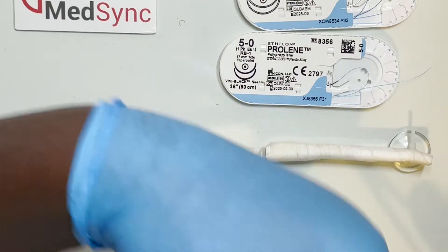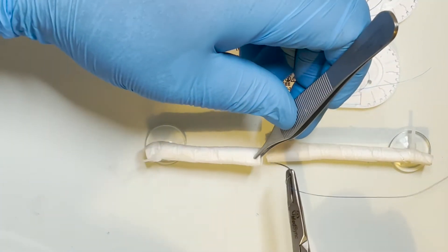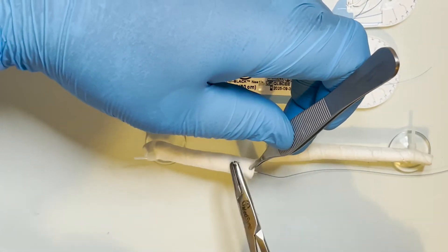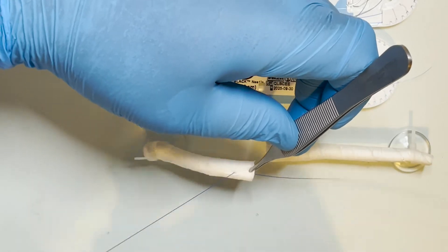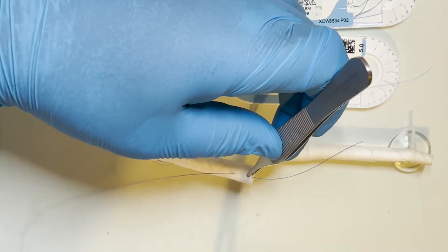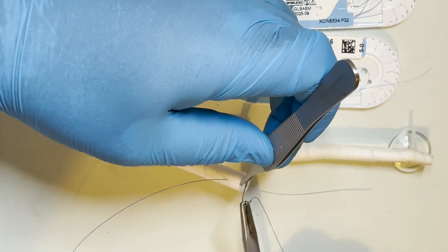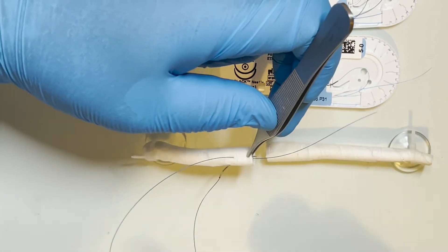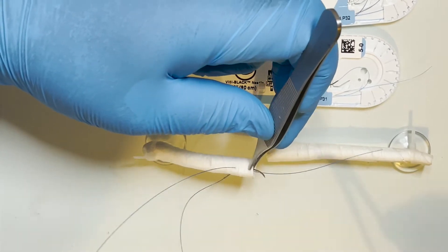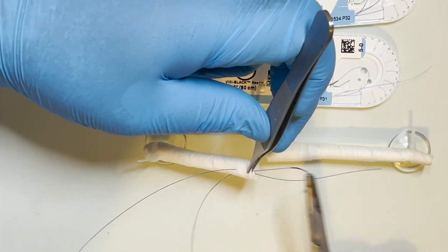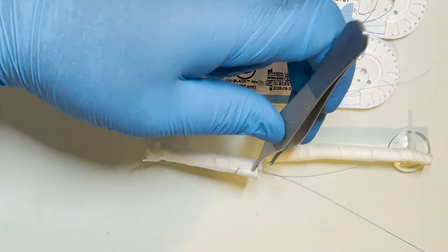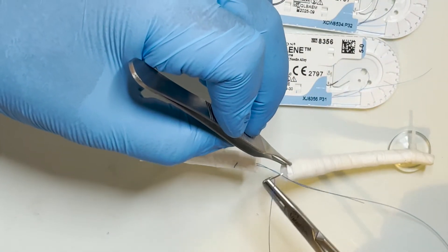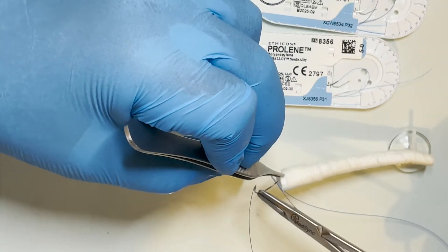The cruciate repair is a four-stranded core repair. As with all tendon repairs, you start with an axial bite through the center of the tendon substance, at least one centimeter from the tendon edge, exiting anteriorly. This is followed by an oblique bite across the divided tendon from one half across the site of division and into the other half of the tendon, exiting through the side.